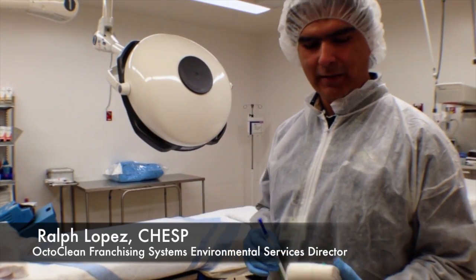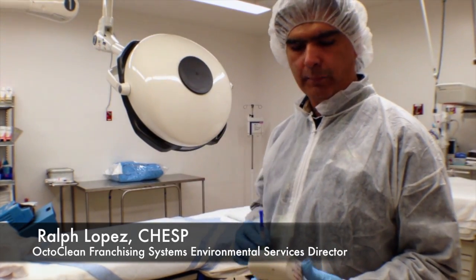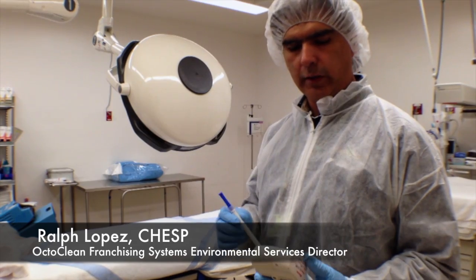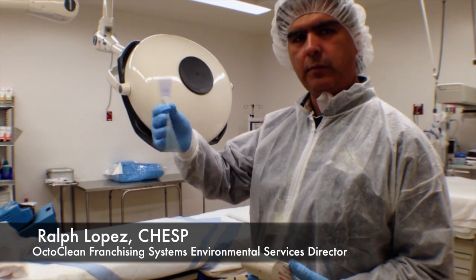Hi, this is Ralph. I'm back again. We've cleaned our surface that we tested in the first part, and now we're going to go ahead and retest with the ATP system. I'm going to get my swab ready and shake it up.